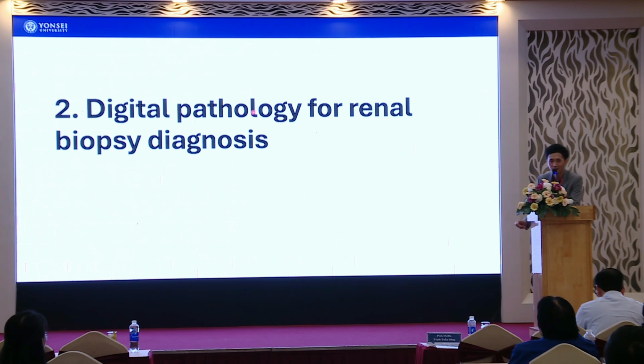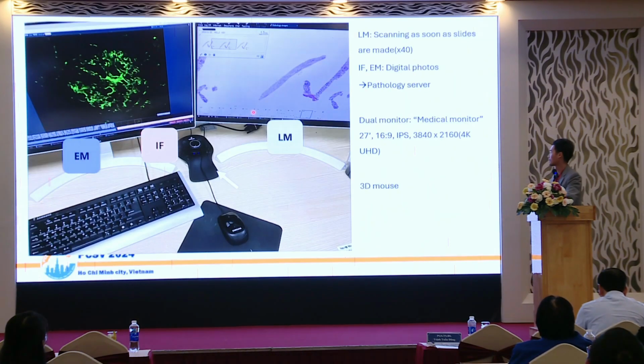Yeah, this ends the first primer of the kidney biopsy, and let's move on to digital pathology. This is one of the settings I use for diagnosis. I make all LM slides scanned once they are made, and make them uploaded along with IF and EM images.